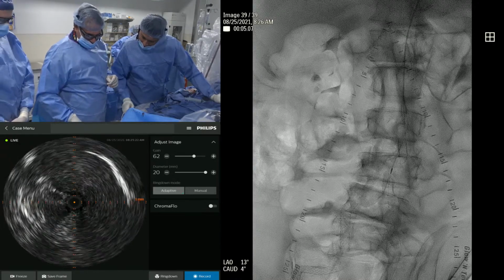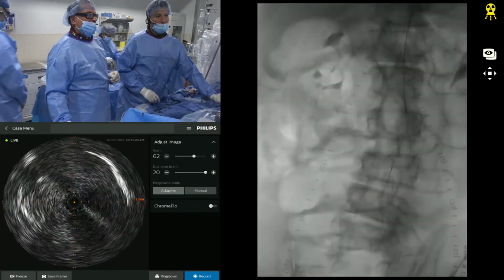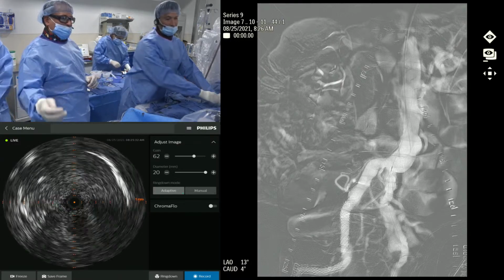Roadmap. Yeah, but the question now is we need to discuss. So let Luke go over some of the techniques, Flora, while we talk about this? I think it's okay. It's a huge aorta. Yeah, let's see. Pull it back. We'll decide. Go ahead, Luke. What do you think?